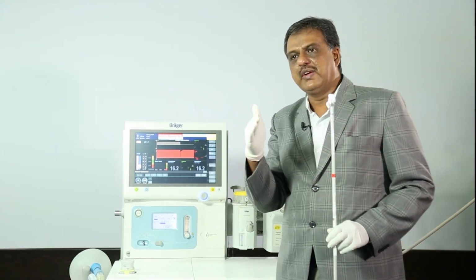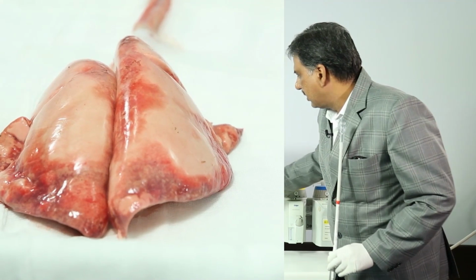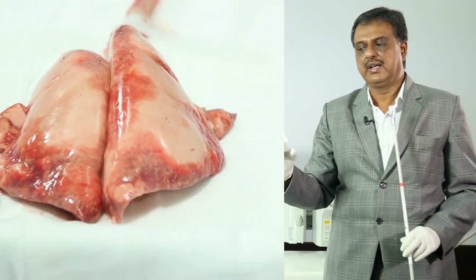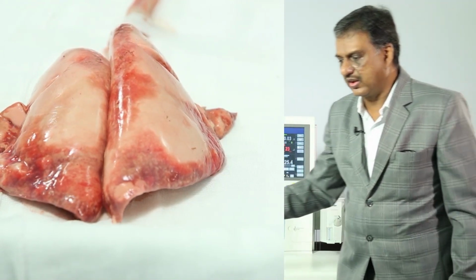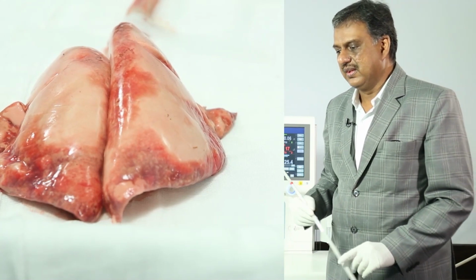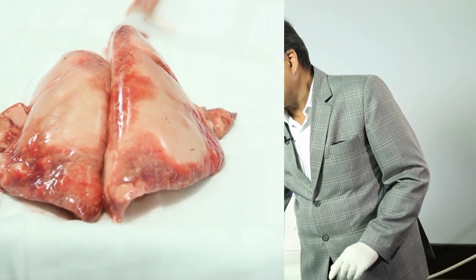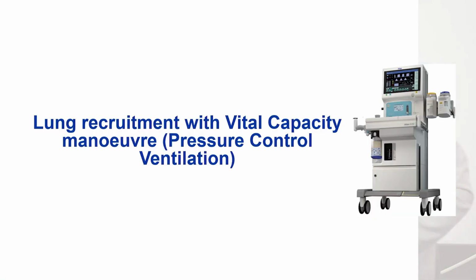It should be given for 8 to 15 seconds and then start conventional ventilation strategies. Now look at the lung surface compared to the previous one. There are more bright structures compared to before.